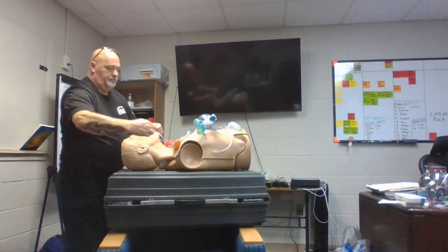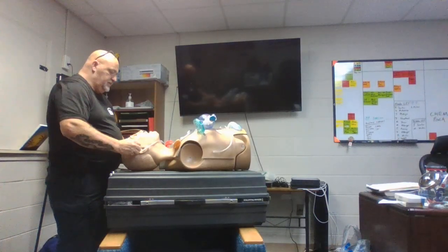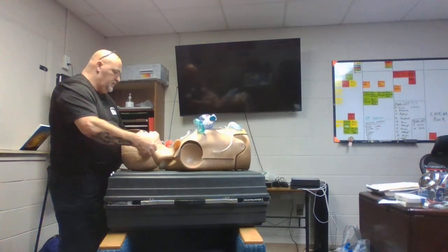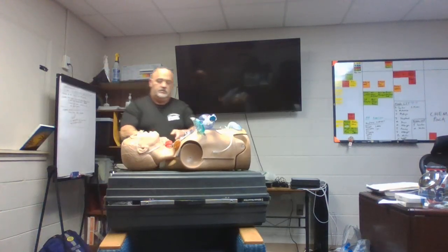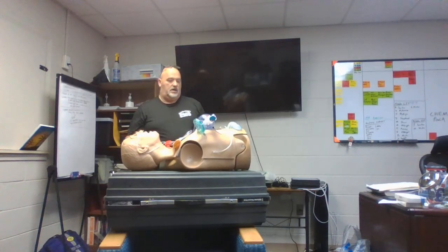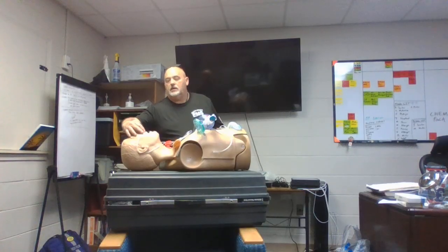We can put it on the patient, and I think every EMT should have to do this backwards in order to pass the state. I'm just saying. So we can put that on. We can assess, right? Is that SAT going up? Is the SAT coming down? Difference between this and the end-tidal is what?